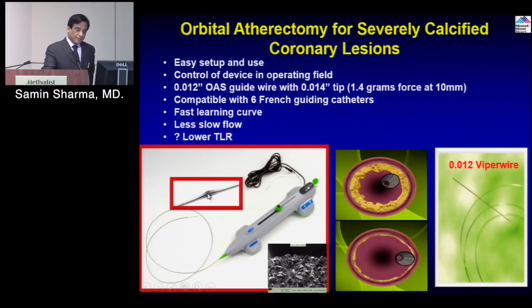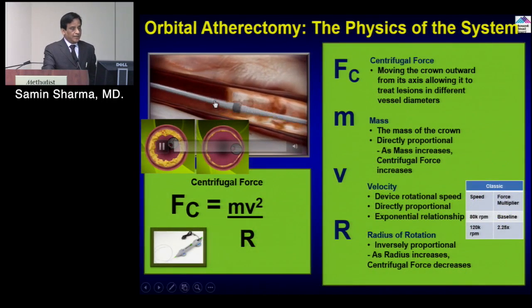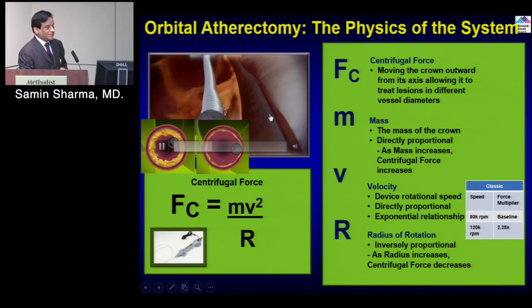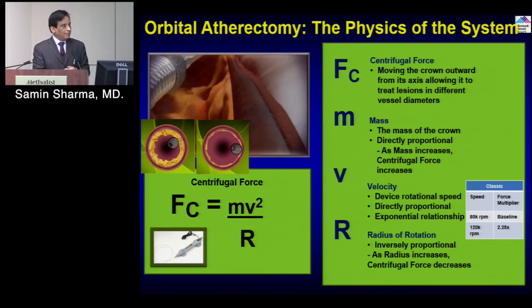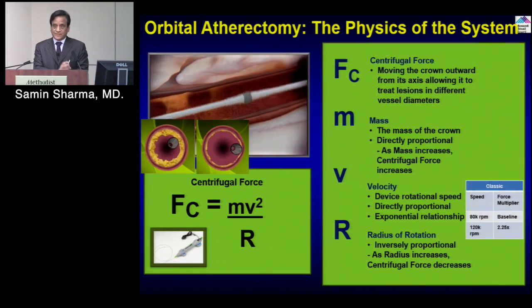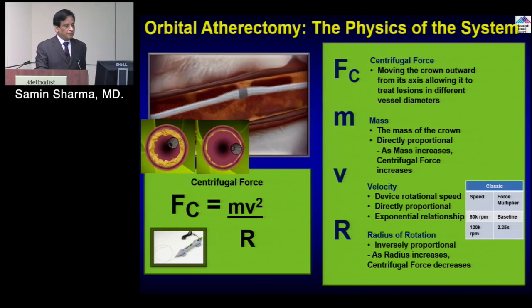eccentric. So it's actually good maybe, because what happens? Once your cone goes into the lesion, it occludes. But if you're eccentric, you are not occluding the lesion while the ablation is being done. So that may be the plus point, and this is how it basically works. You can say, well, it's really causing too much trauma to the vessel. It looks that way in the animation, but overall, in these calcific lesions, that is probably what we want. We want a fracture of the calcium, whether it makes debris or not doesn't matter, so our stent can further expand.